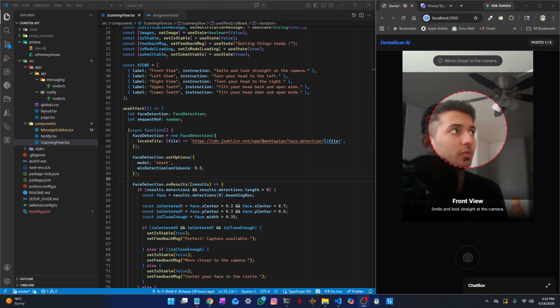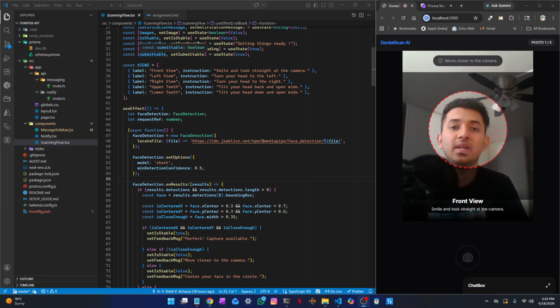And in this video, I'm going to discuss the architecture design with this demo. I'm hoping that the video is recording. Okay. So the first thing is, in order to detect the face correctly and to make sure that the user is actually visible, the profile of the user is very much visible, I have used MediaPipe. In that MediaPipe, I've used the face detection model. That's a small model, and I've used a minimum confidence of 0.5.